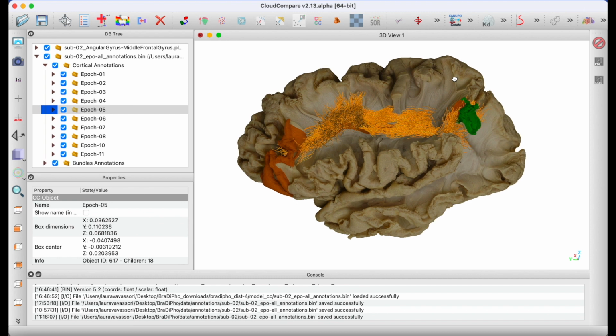Overall, by having both in vivo tractography and ex vivo dissection within the same space and in a 3D rendering, I was able to verify, first of all, the existence of my connection. Then, to test the anatomical reliability of my tractographic reconstruction, and on top of this, I was able to gather information about the anatomical features that constrain the mediolateral organization of these fibers.